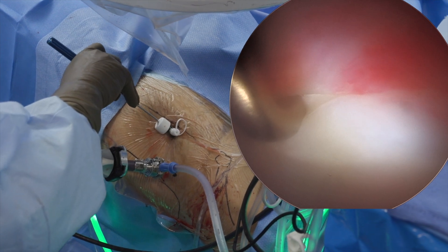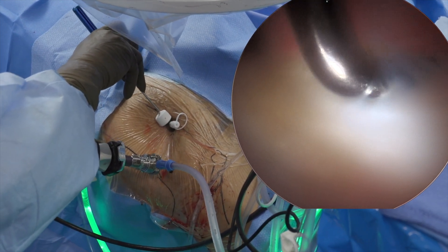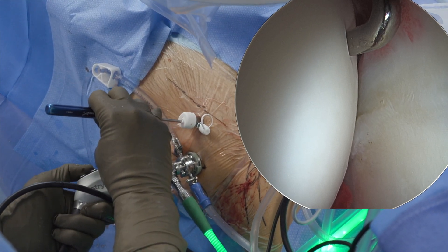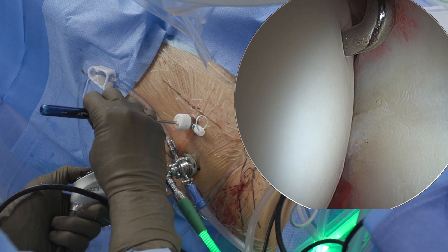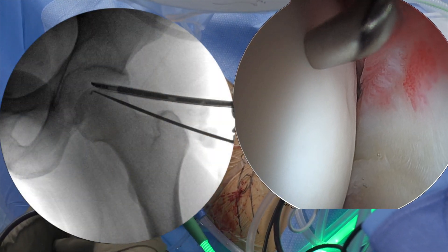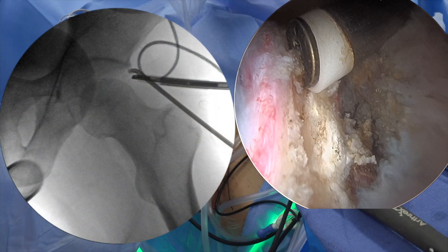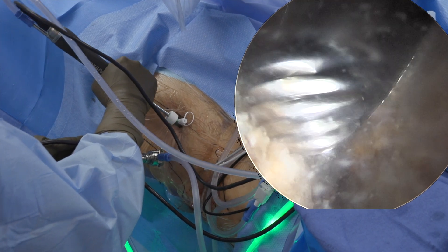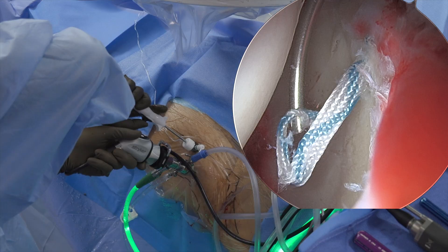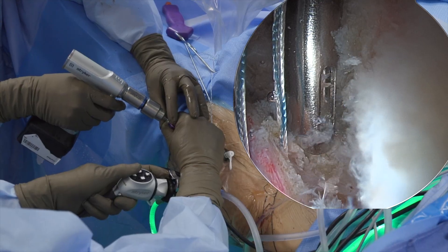The labrum was inspected, which demonstrated detachment from the 11 o'clock to 12:30 position and associated chondral delamination. Inspection of the femoral head demonstrated softening over the anterior superior femoral head with a chondral fissure, and the area was marked with the probe. The acetabulum adjacent to the labral tear was exposed and rim trimming was performed with the 5.5 mm burr. Two No. 2 sutures were passed around the torn anterolateral labral tissue and secured to the acetabular rim using two anchors.